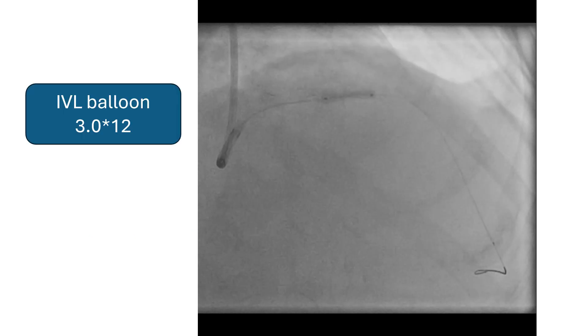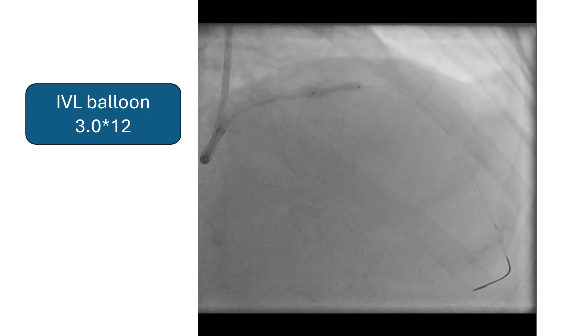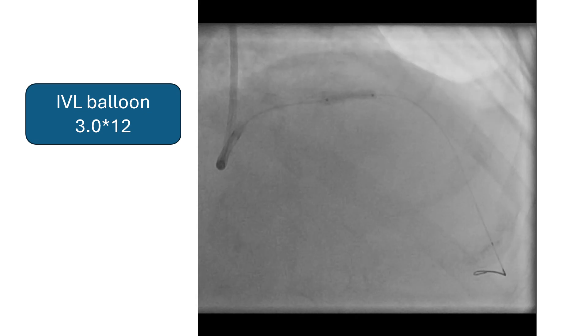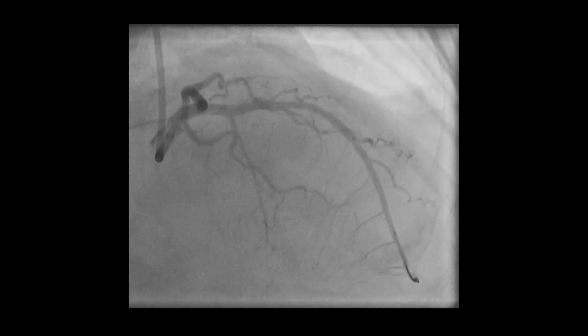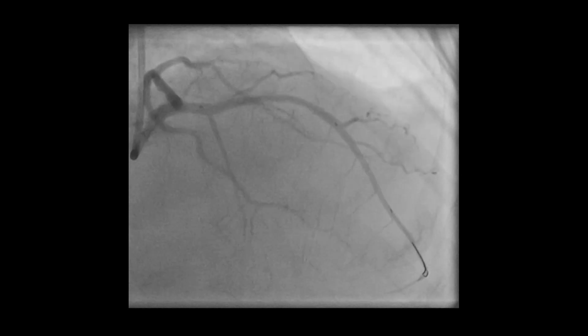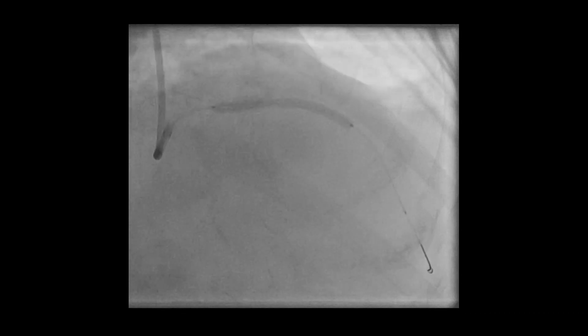In this case, we used a shockwave IVL balloon 3 by 12, with all eight runs. IVUS showed some fracture of the calcium. Further dilatation was done by NC balloon 3. Then a stent was deployed 3 by 38, positioned in the lesion and deployed with apparently acceptable expansion, but post-dilatation was done.